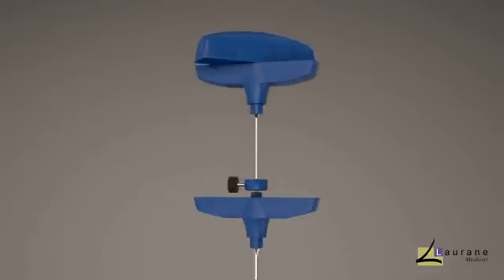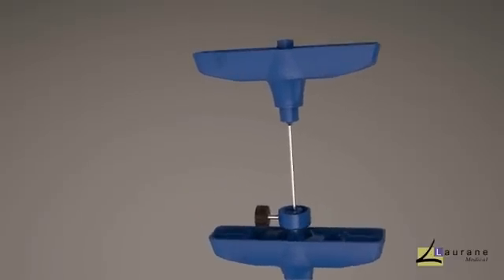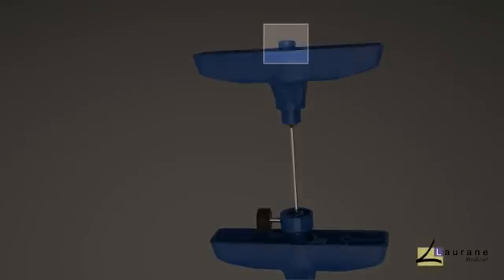If aspiration is required to sample a lytic mass or gather blood, a syringe may be attached to the luer lock feature of either the biopsy needle or cannula.